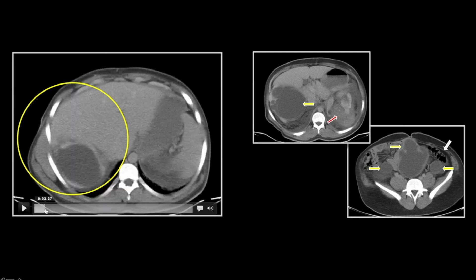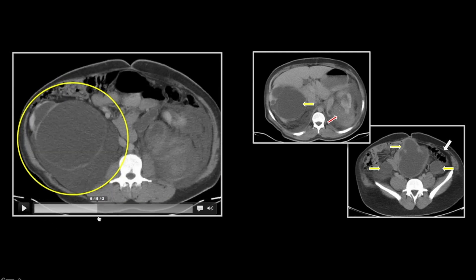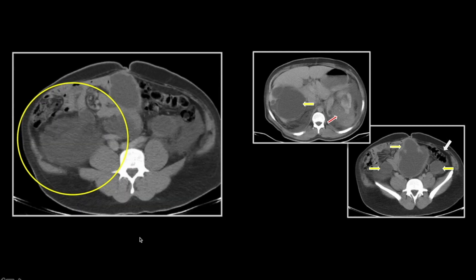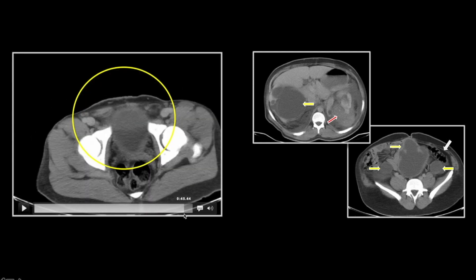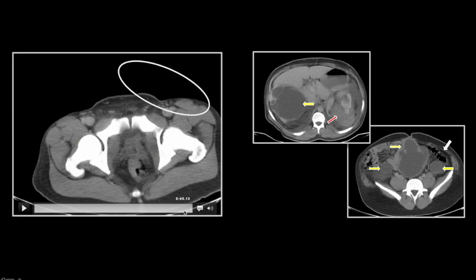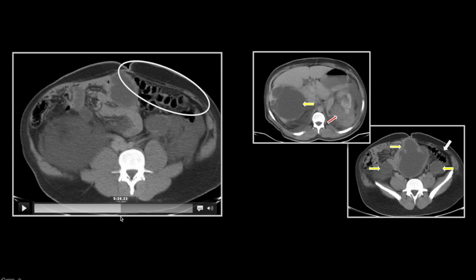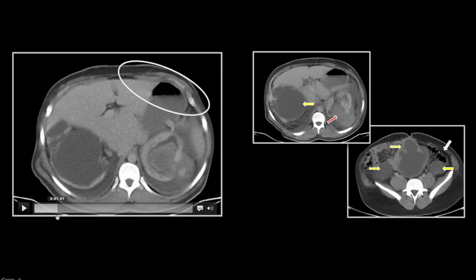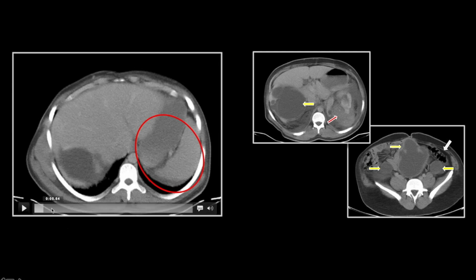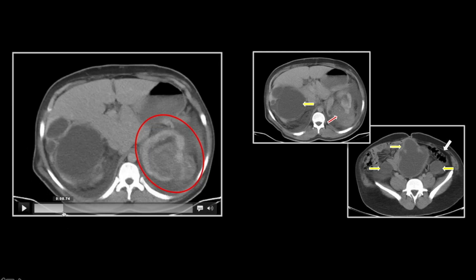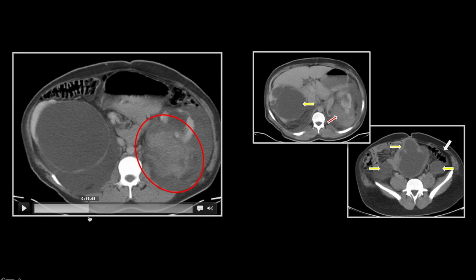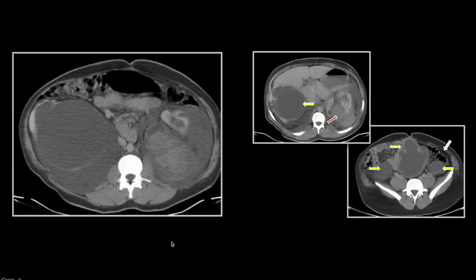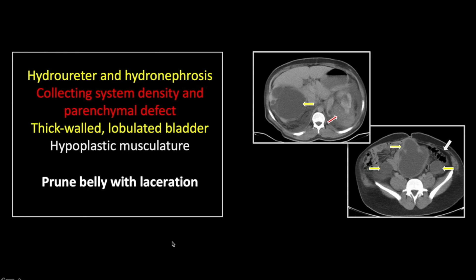Let's first view the uninjured right kidney with its markedly dilated collecting system and chronically atrophied parenchyma. You can appreciate that lobulated, thick-walled, dilated bladder, and here we go back up through the absent abdominal wall musculature. And last, we will appreciate the atrophied parenchyma of the left kidney with that through-and-through defect and a great deal of hyperdensity consistent with hemorrhage and clot. So that is a case of prune belly syndrome with an associated laceration.